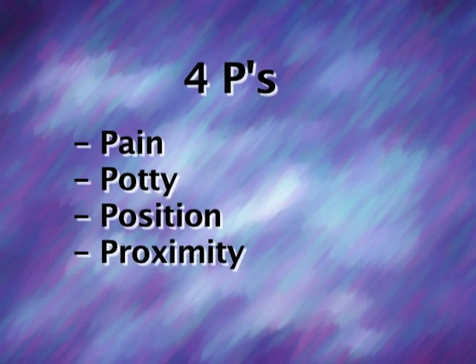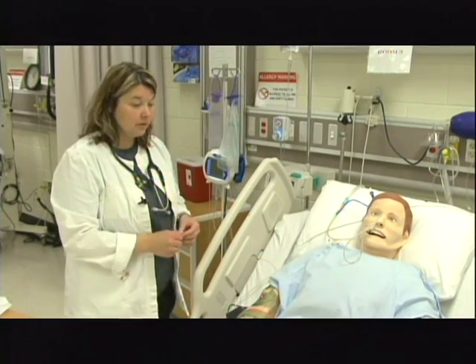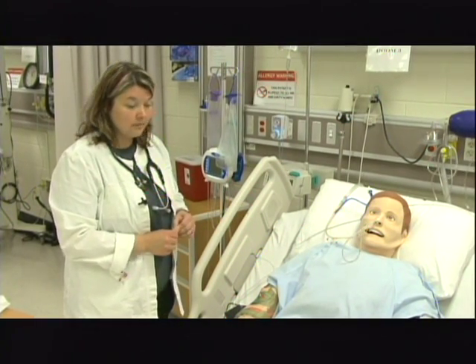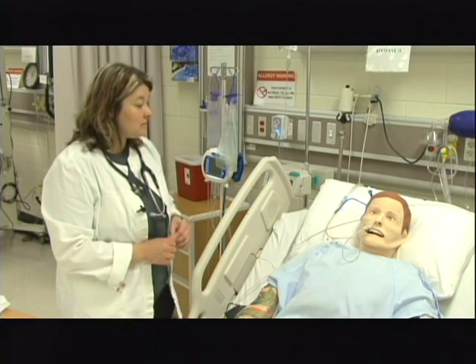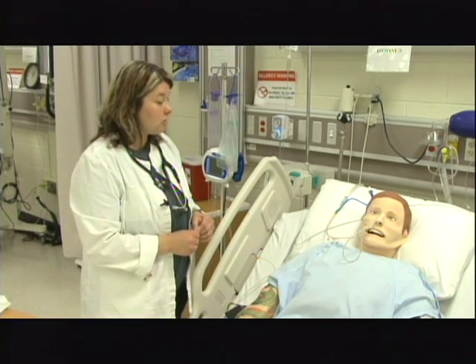I need to verify any allergies that he has, making sure that he doesn't have any allergies to latex or any equipment that I'm using. He does not have any. I'm going to go ahead and explain to him what I'm doing and give him a duration. Mr. Smith, I'm going to be giving you your morning medications, and they do include some blood pressure and heart rate medicines, and you know that I've already checked your blood pressure and heart rate.